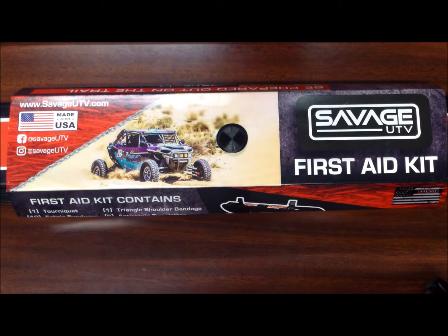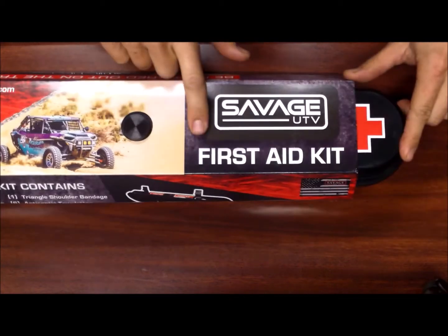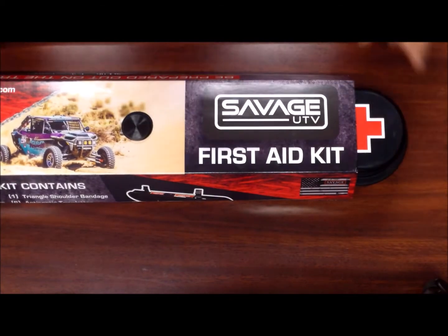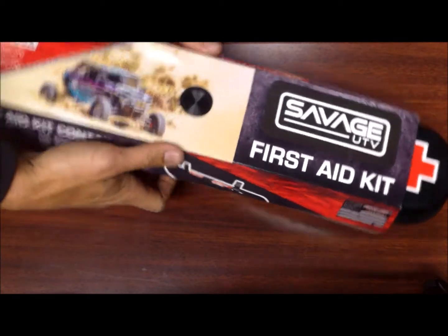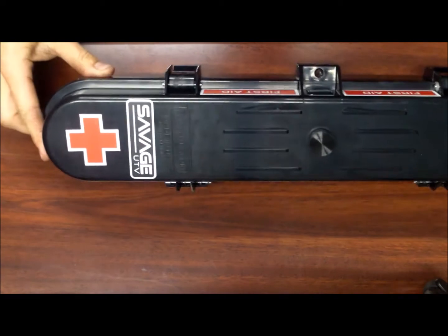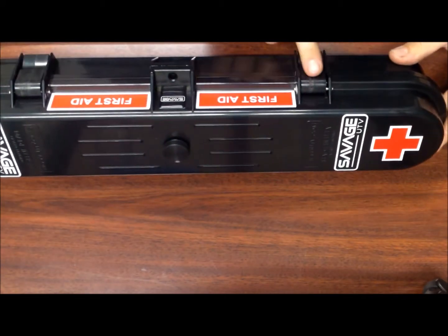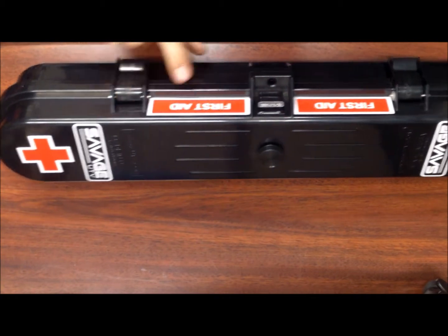Hey guys, it is Matt with Savage UTV and today we are going over the first aid kit unboxing, just to show you guys what this product is and what comes with it. This is our standard case — it is airtight, waterproof, and mounts right on any roll cage. You can see there are two buckles here to keep it shut.